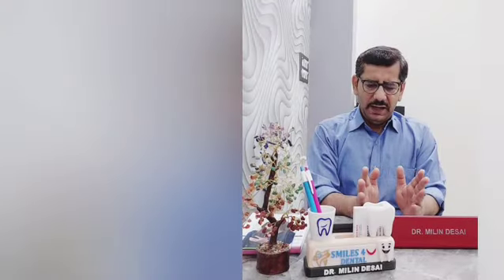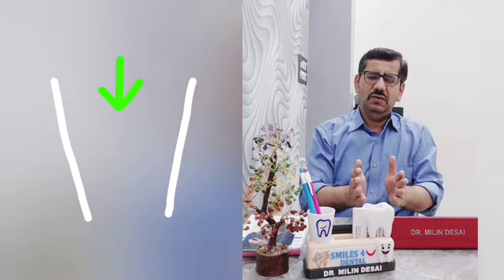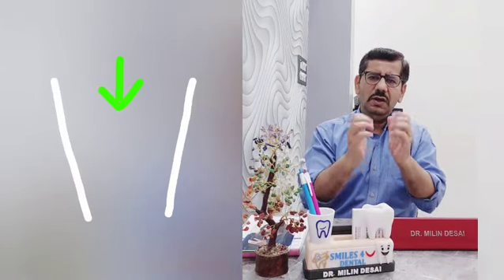Plus you plan it that way so that your access walls are giving you proper access. If you are being more conservative, then there are chances of missed canals and ledge formation. So always plan your opening in such a way that gives free access to the files. If there is free access, your file flow will be smooth and your root canal journey will be very smooth. So I call your access opening your GPS.